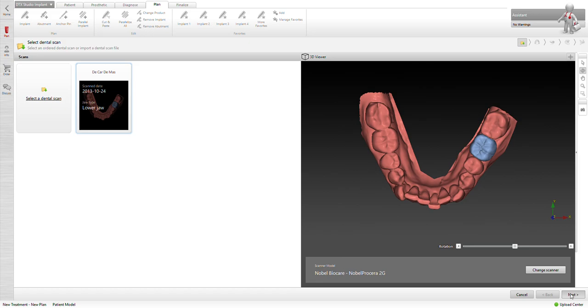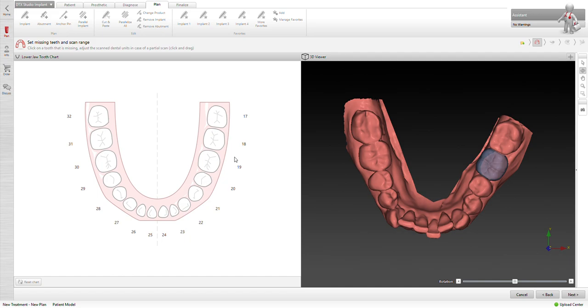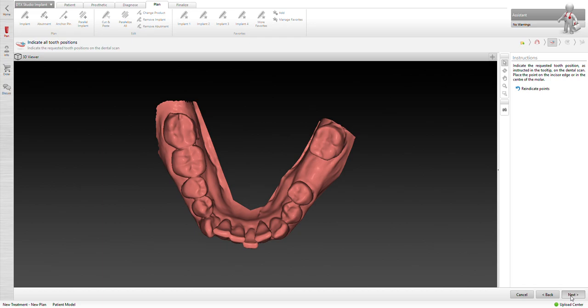The reason for doing that is that it allows DTX Studio Implant to pick up on the nuances that are associated with each scanner and the data associated with it. We go ahead and hit next. I have to deselect the missing teeth. We know that 19 is missing, but because we don't have thirds and the arch doesn't go all that far back, we're not going to click on the tooth but to the adjacent to remove 17 and 32.